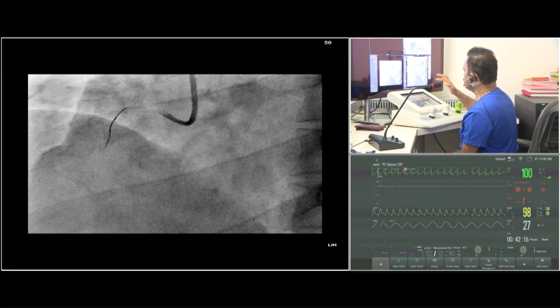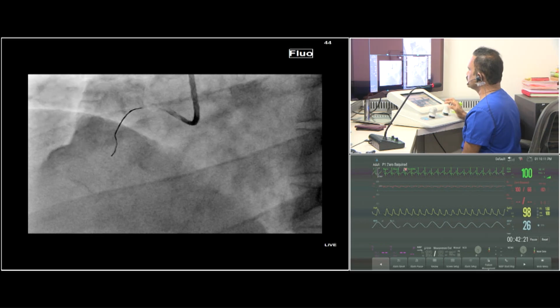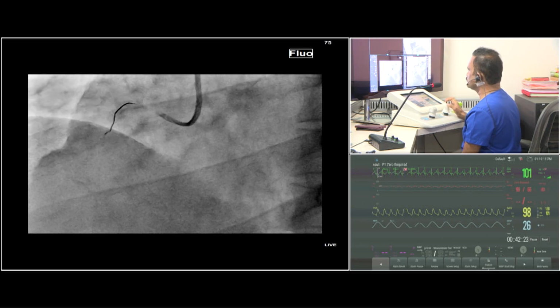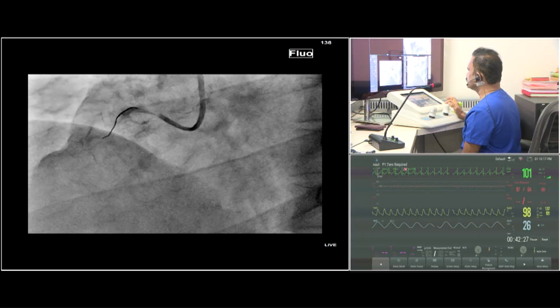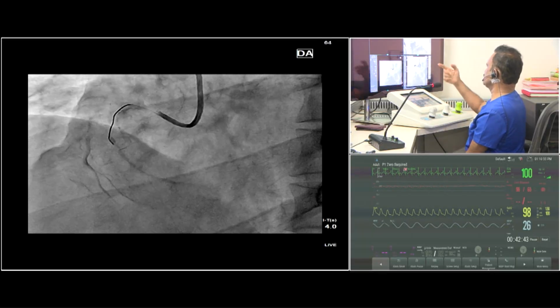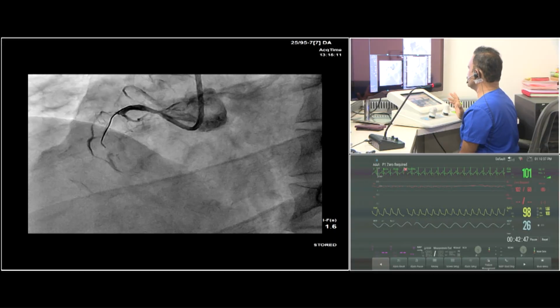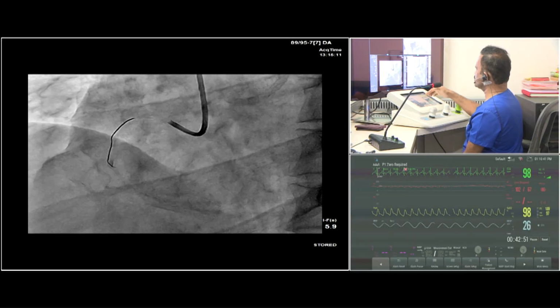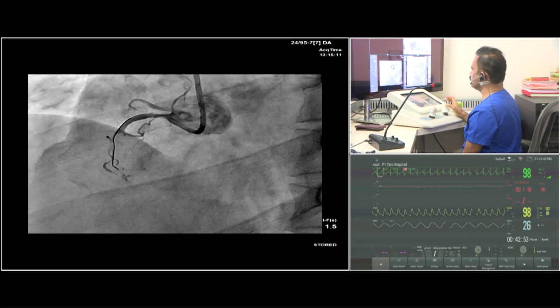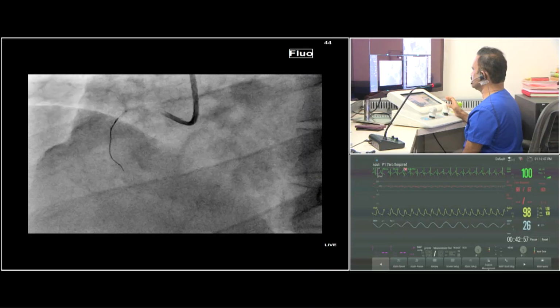The ROR will be used there, it will rotate. You can see that whatever the CTO segment or the occluded segment, we are able to cross with the ROR and the spin movements, what we see with the wire, what we do with the hand. I have used the robotics for that, and I am progressing the wire forward now.